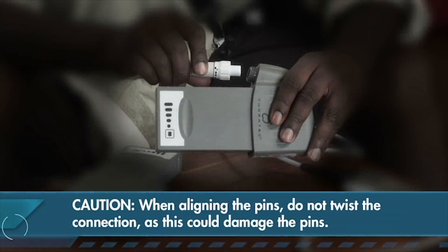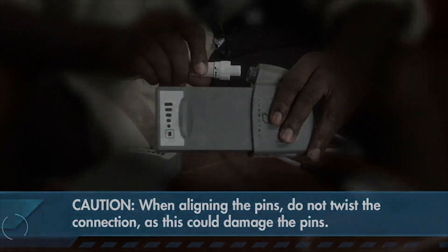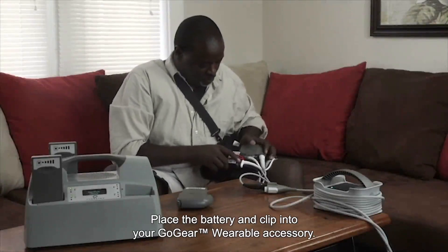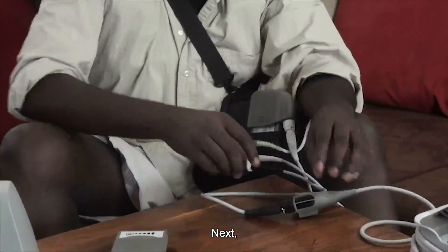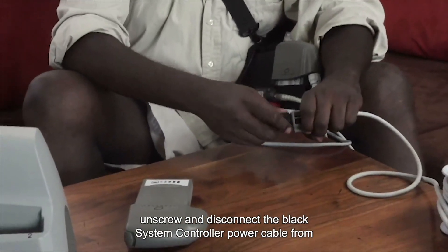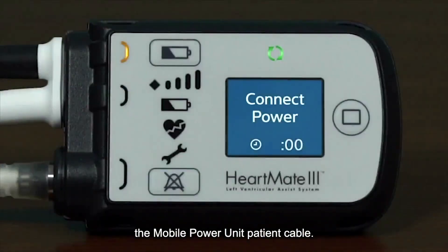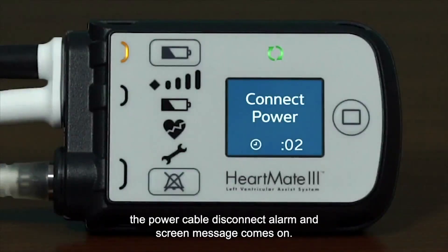When aligning the pins, do not twist the connection as this could damage the pins. Place the battery and clip into your GoGear wearable accessory. Next, unscrew and disconnect the black system controller power cable from the mobile power unit patient cable. Again, the power cable disconnect alarm and screen message comes on.